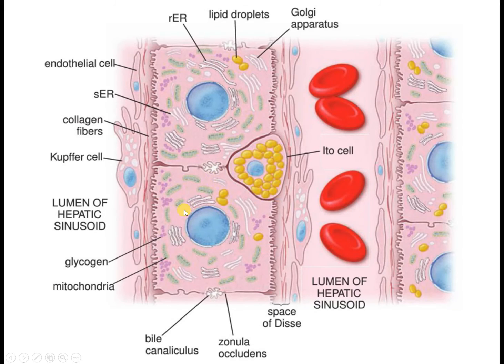Okay, finally we discussed amino acids, proteins, and carbohydrates. Here we have a lot of mitochondria, which is necessary because hepatocytes are the factories of our body. They produce a lot of materials, and the functions are very distinct, but very interesting. And here, this cell, we just avoided attention to this cell, the Ito cell.